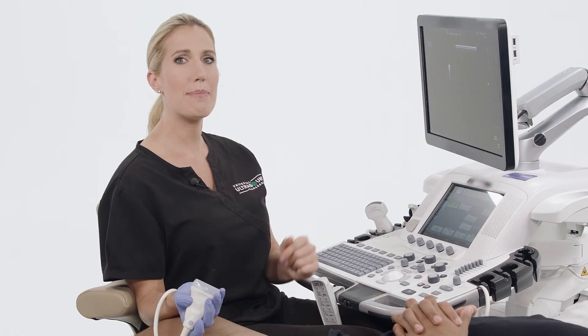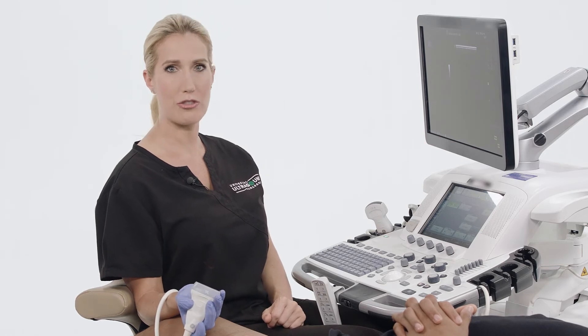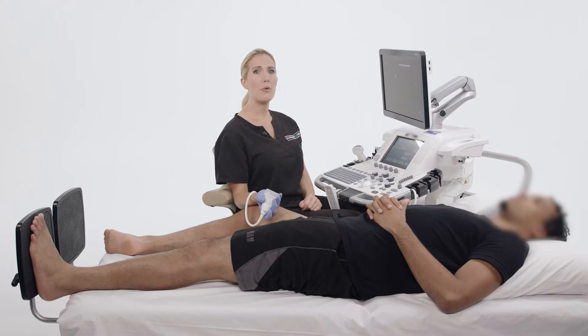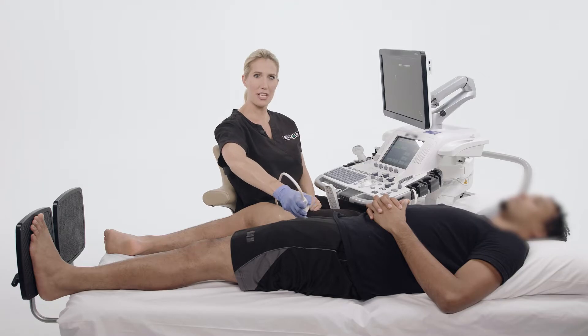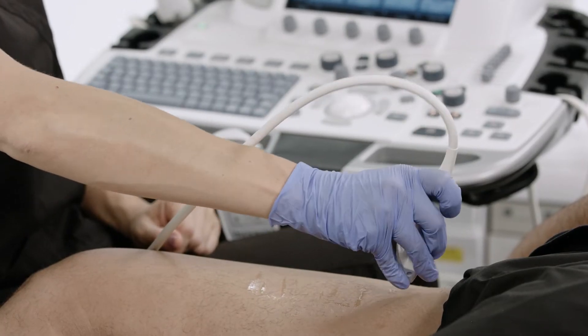This is why we raise the patient's bed when setting up our ultrasound environment. Furthermore, your arms should have a solid base of support. Holding your arm in the air for the entire part of the examination is not ergonomically viable.